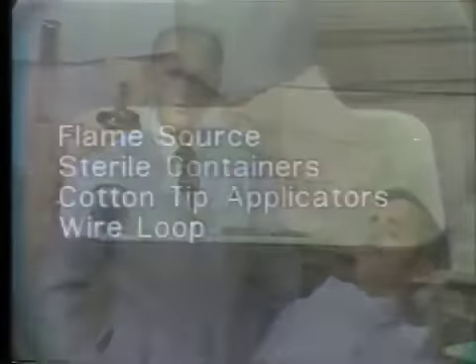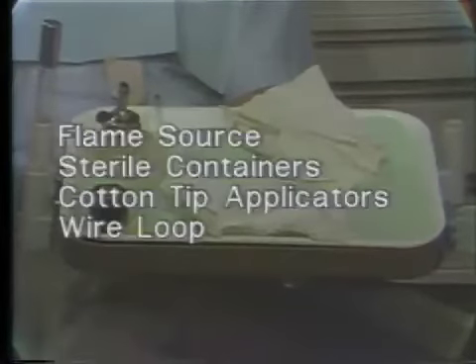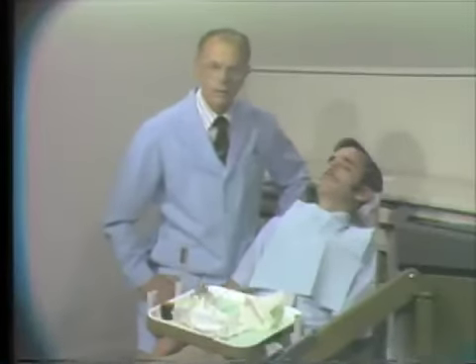The collection of a bacteriologic specimen is done for the purpose of identifying a pathogen which has caused infection in the oral cavity, and also to determine what antibiotics may be effective against the pathogen or pathogens. The equipment that is used for the collection of the specimen is a flame source, sterile containers, cotton tip applicators, and a wire loop.